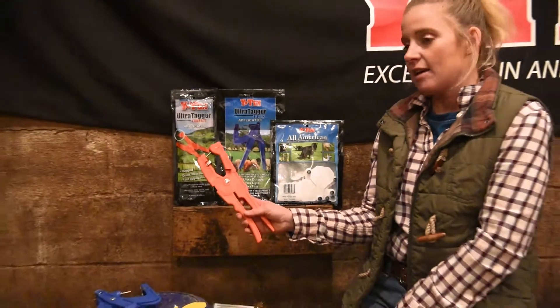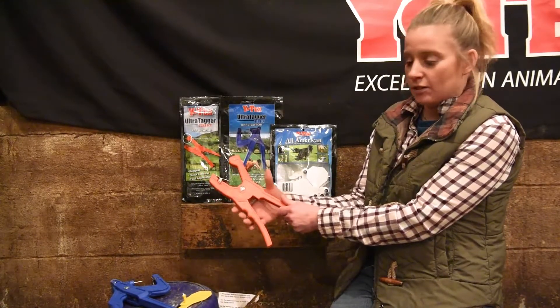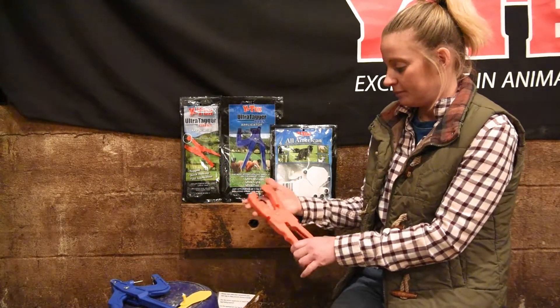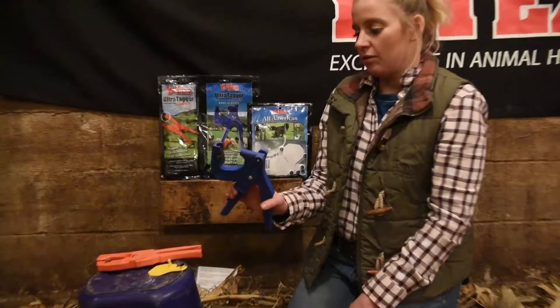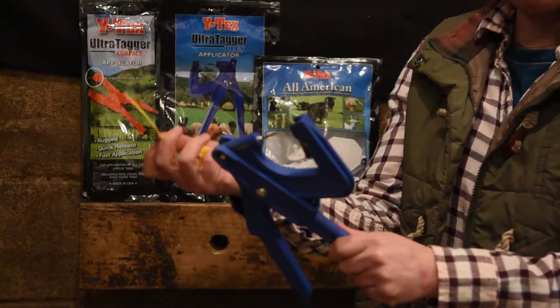This is the Ultra Tagger Compact. It has a quick release pin, so you don't have to open the handles to release it from the ear tag. Today, we're going to use the Ultra Tagger Plus, the blue tagger. I'll show you how to load that with our 3-star All-American Tag.